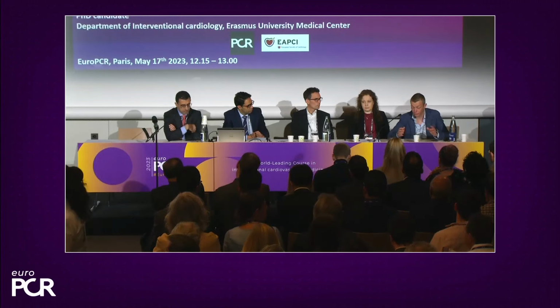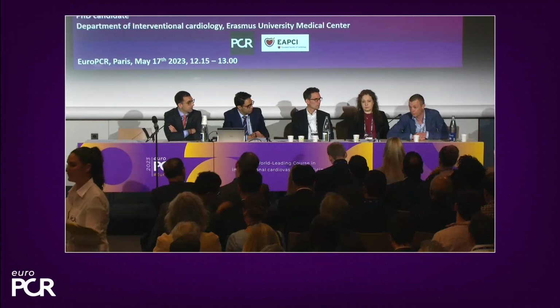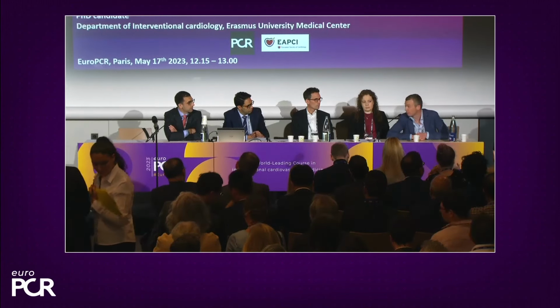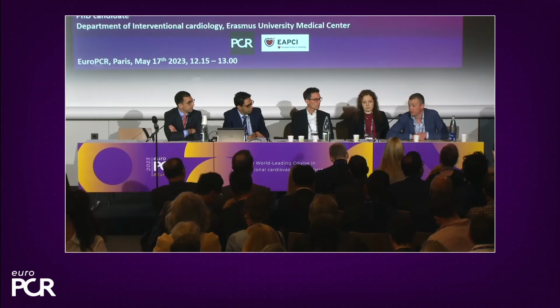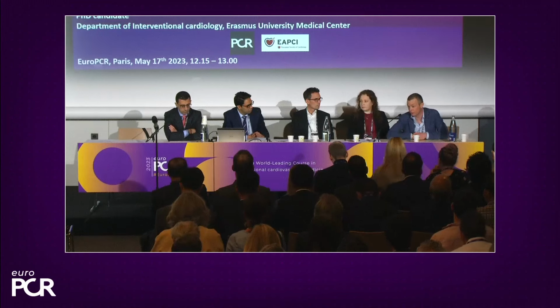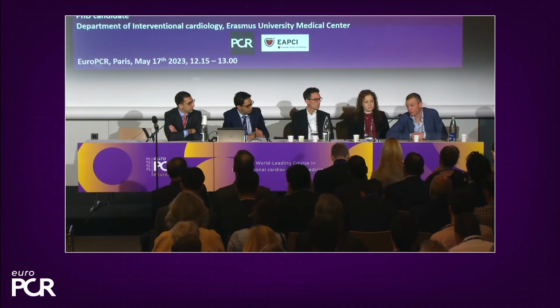No. So we know that this technology is likely not suitable for patients with ostial lesions. The technology has not been properly validated in a STEMI setting, and perhaps the most critical issue with the concept of angio-based physiology in general is the fact that you need two decent orthogonal angiographic projections, as Alessandra will show you in a second, without significant foreshortening or overlap.